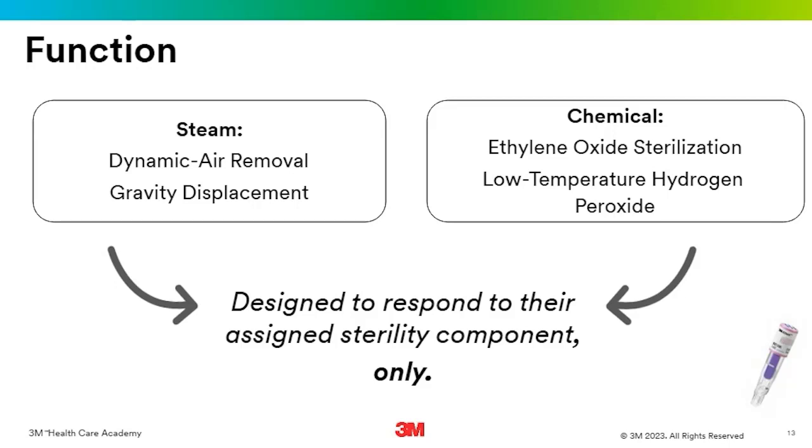And right, you just go down that leadership cycle where now you've got to call maintenance in. And then you look and it has steam tape on it. You're like, oh, and then you think back to the day when you did that, right? Because we all did that. We've all put steam tape on a chemical product and put it inside of the chemical sterilizer. We've all done that, right?